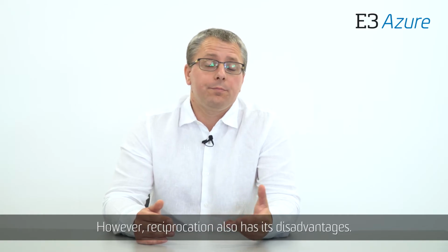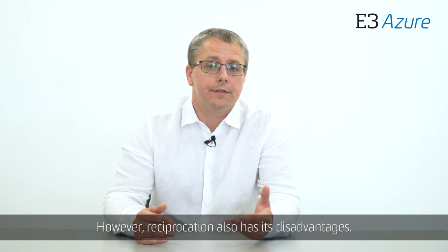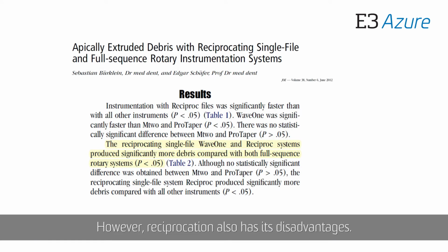However, reciprocation motion also has its disadvantages. Firstly, in reciprocation, we may have an increased transportation of debris toward the apex during the counterclockwise movement.